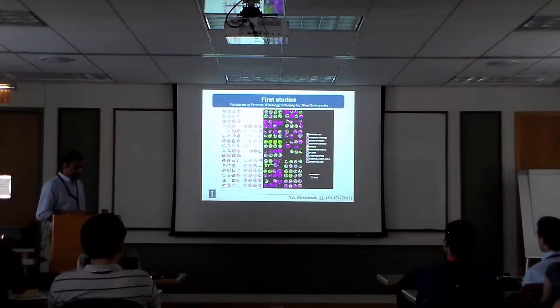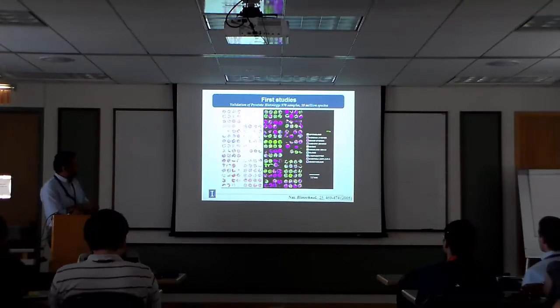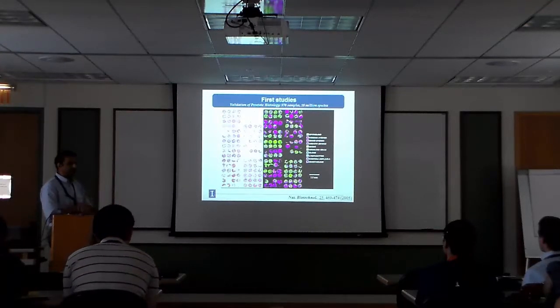Okay, so just to get you oriented with what you're going to look at, this is the aforementioned H&E you saw on the previous slide. What you'll see here are images that look like this. These images are color-coded, and there'll always be a key on the side. So if you want to figure out what color is what, the whole presentation has consistent colors.